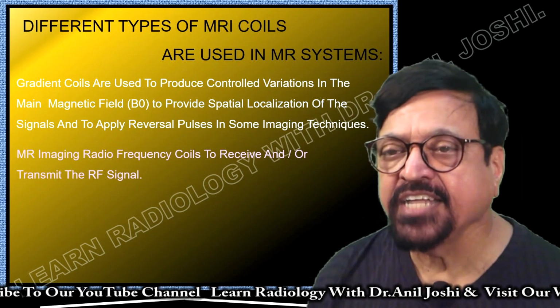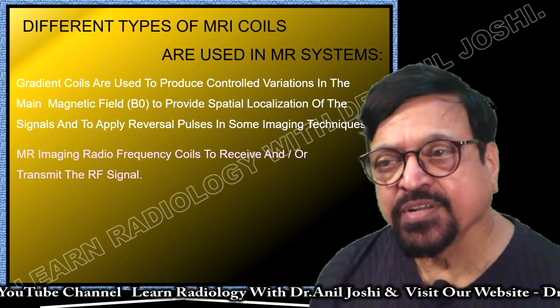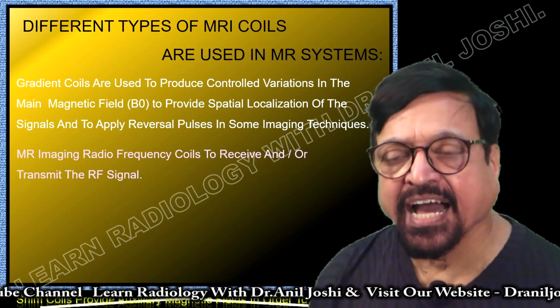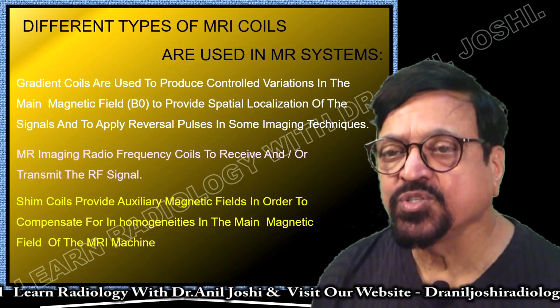Now MR imaging radio frequency coils are there to receive and to transmit the RF signal. So it works both ways: receive also and send also.